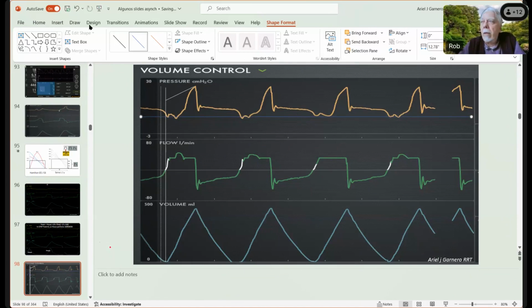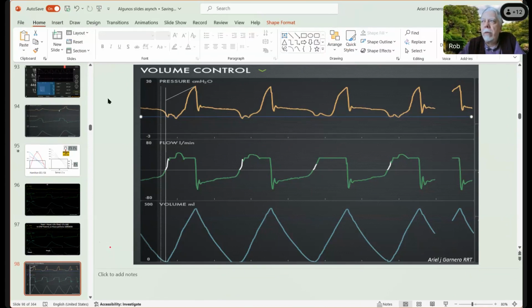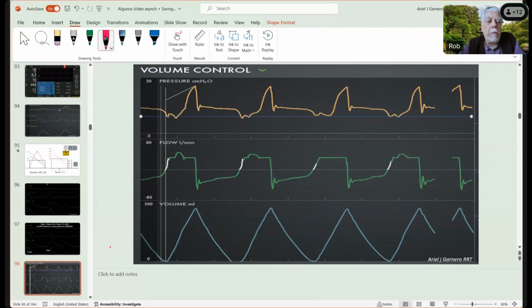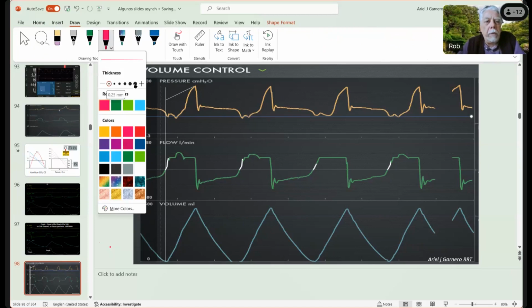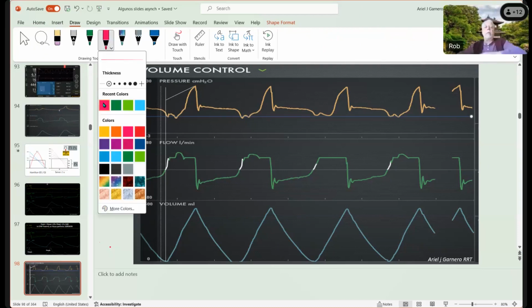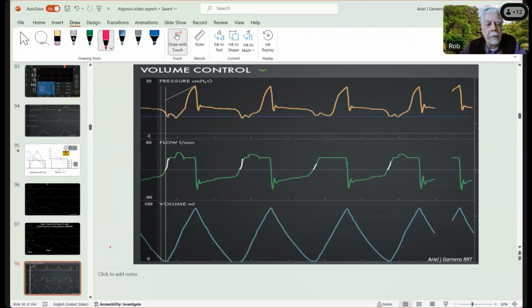But it's sort of like isotonic. What do you call it when you push against a static thing? Isometric. It's an isometric work contraction. Right. So you wouldn't measure much work mathematically because no volume is being moved with the pressure, but the muscles are clearly contracting, right? So they're doing isometric work. You're burning calories. So again, as this relates to comfort, it's probably not comfortable for this patient.